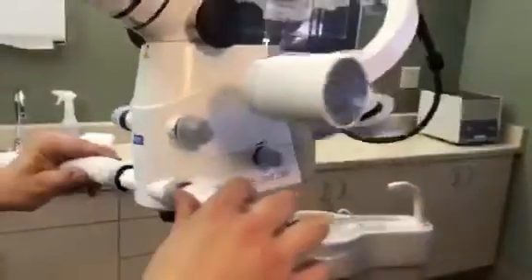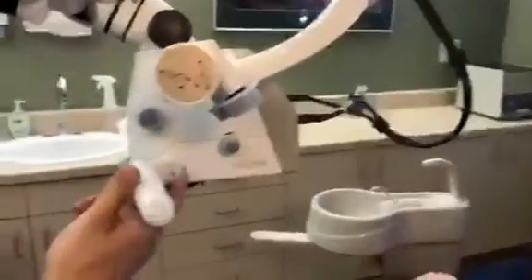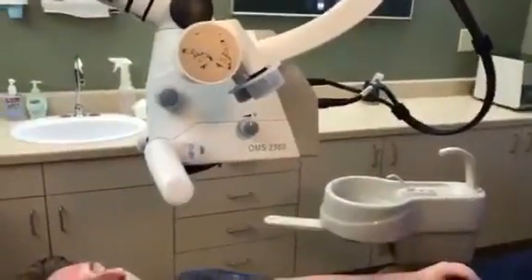The last thing your microscope has is pictures and video. Once you're hooked up to a monitor, you'll be able to utilize that feature.